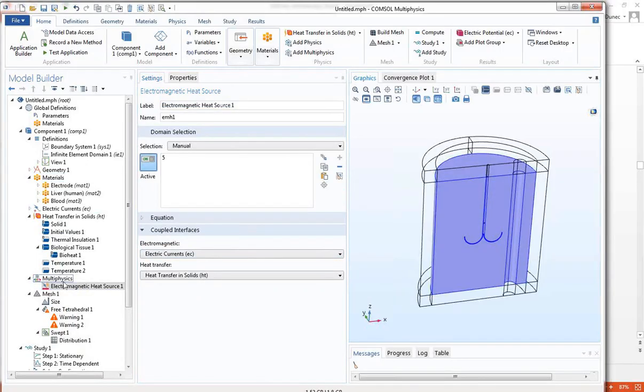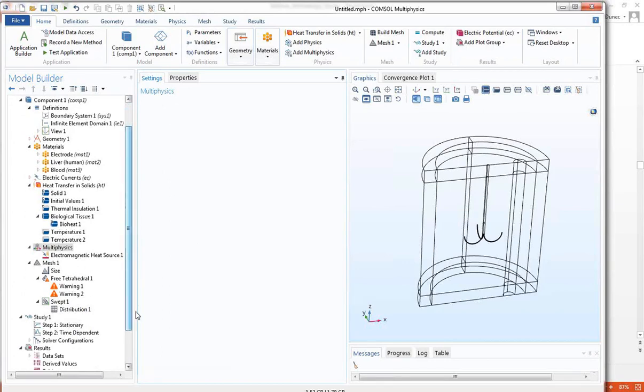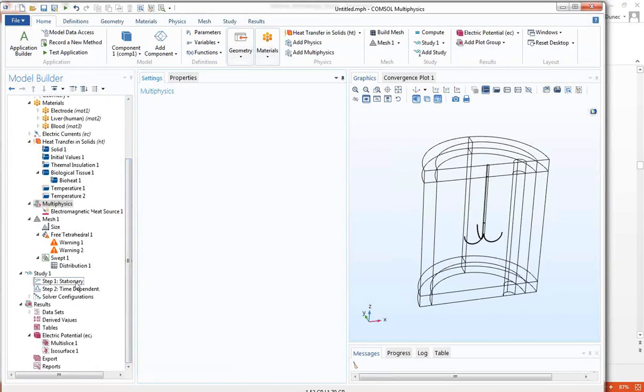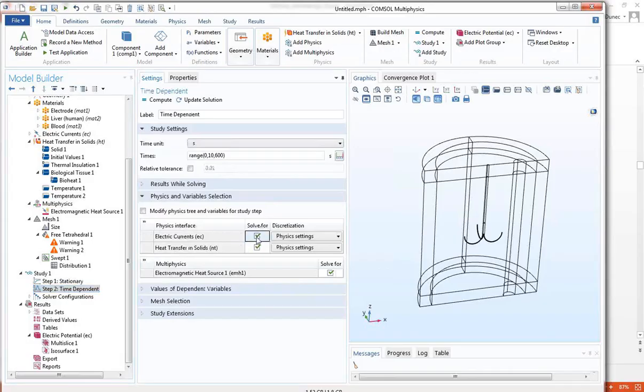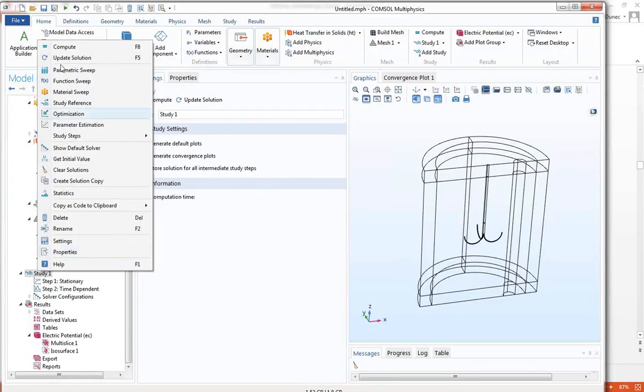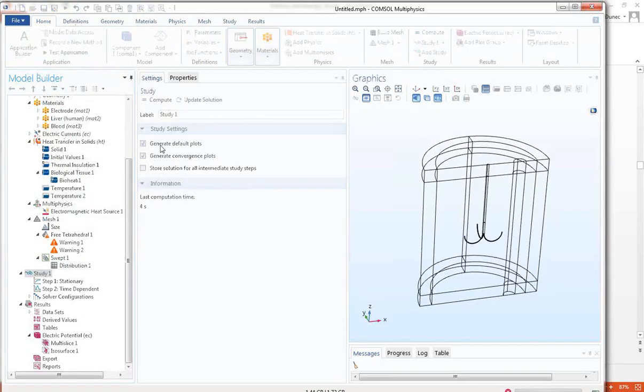And then answering the question of someone that had asked, what about temperature dependent? Then what I do is I'd right click and I'd send temperature coupling to send the temperature back. And then I could solve them simultaneously. I'm not actually going to do that in this problem, just to make it go a little bit quicker. So in the stationary step, I want to solve for the electric currents. And then using that result, I want to solve for heat transfer. Let's go ahead and do that. Right click and hit compute. Okay. And away it goes.